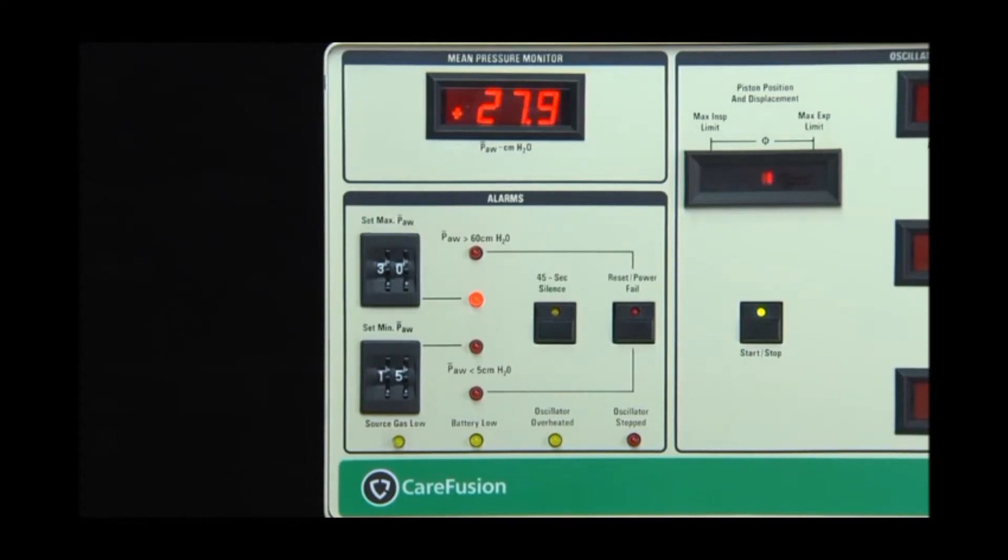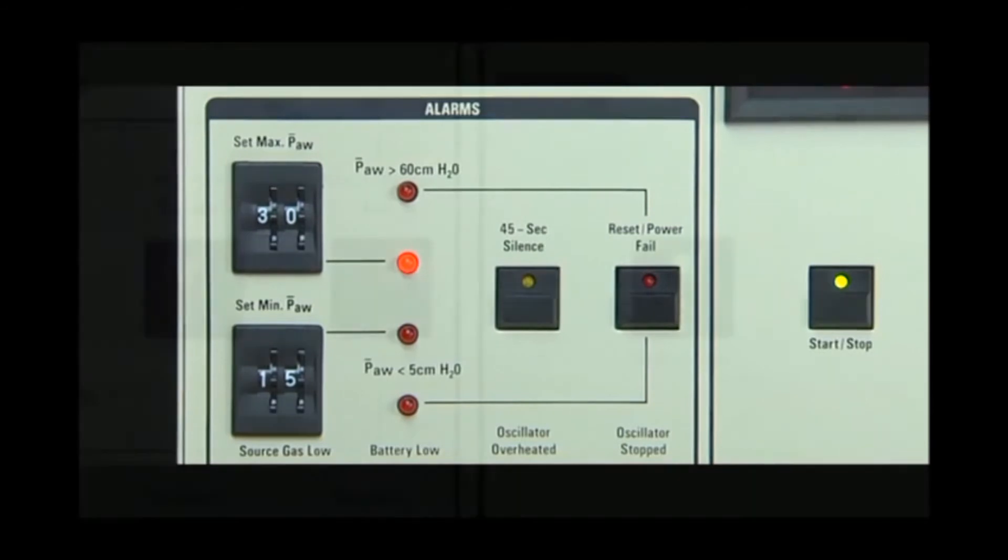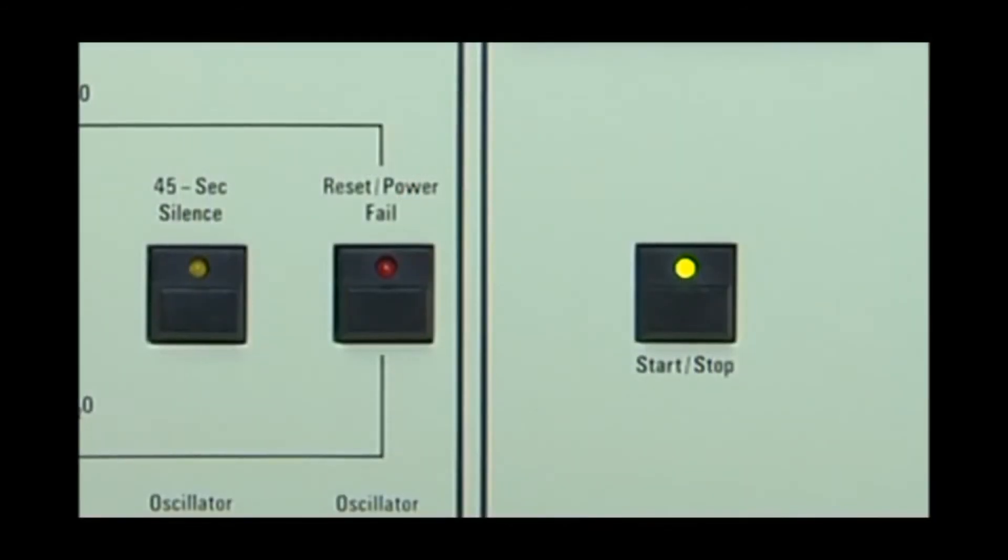At this time, the valve will re-pressurize to its operational state. However, the visual alarm will remain on. In the event that the high mean airway pressure alarm condition persists, the limit valve will continue to cycle until the fault condition is resolved. Pressing the reset power fail button will reset the visual alarm.